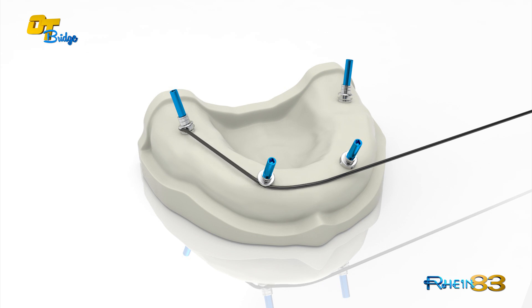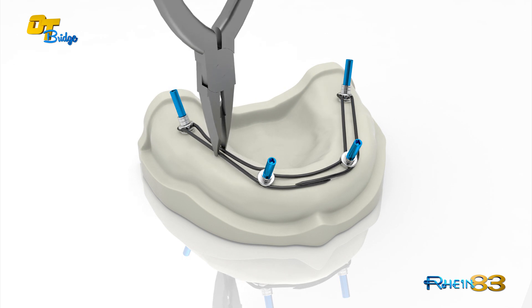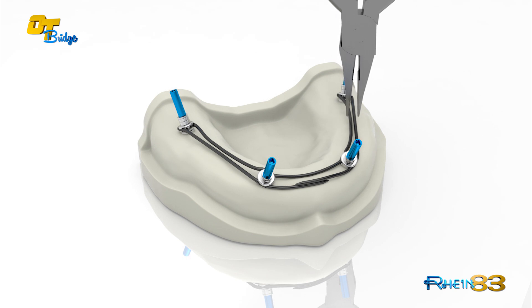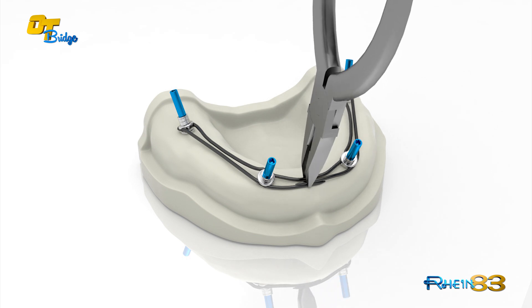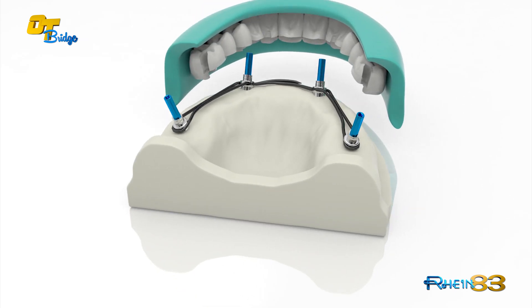The lateral holes allow the insertion of a titanium wire that will be adapted to the ridge shape. The technician finalizes the full arch temporary denture with some resin.